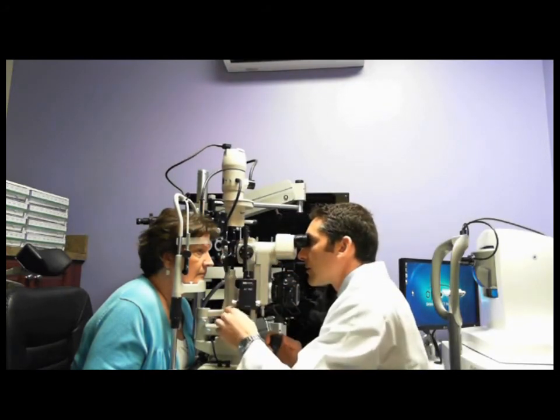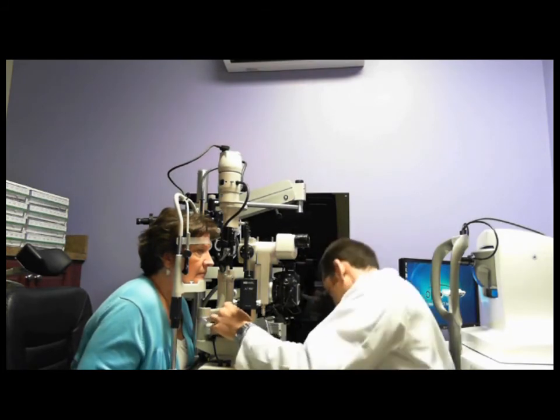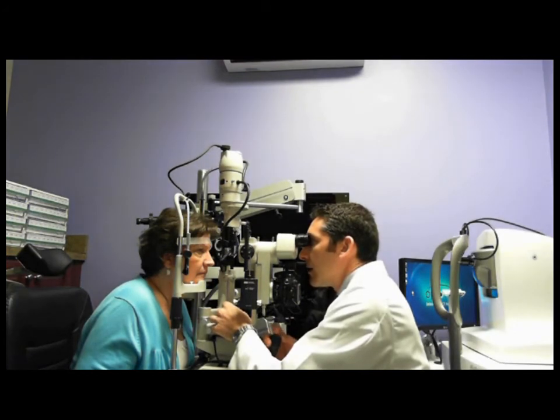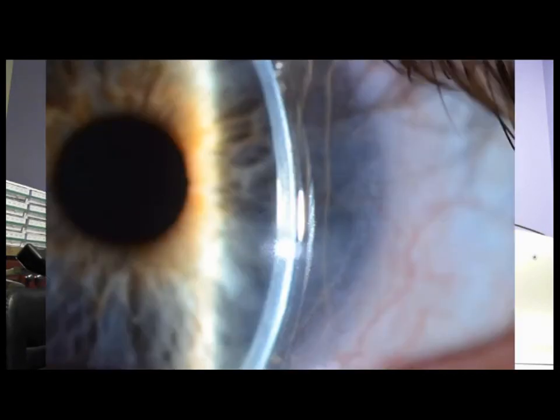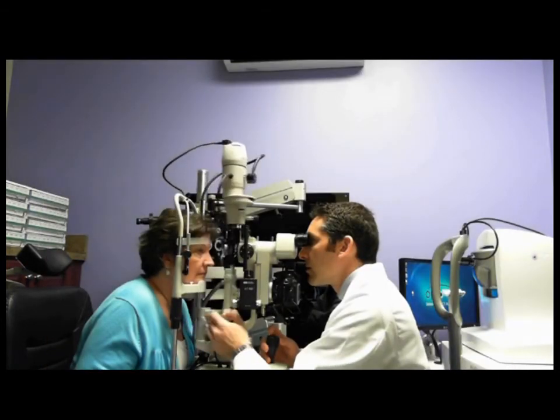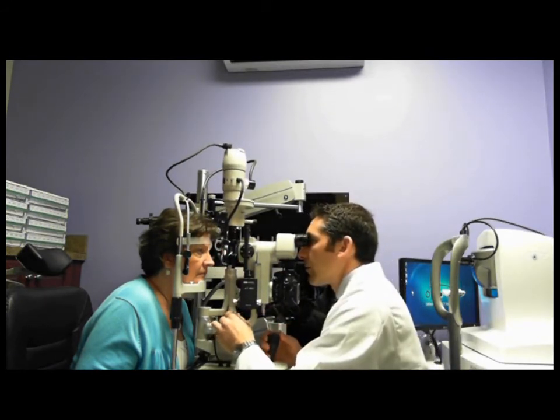When you're judging the amount of vault, what you want to do is compare to a known thickness. The known thickness in this case is going to be either the thickness of the cornea or the thickness of the lens itself. Sometimes it's easier to use the thickness of the lens itself because you know exactly how thick this lens is. And so when I'm looking at the vault, I see vault all the way, limbus to limbus, both nasally and temporally on this left eye.